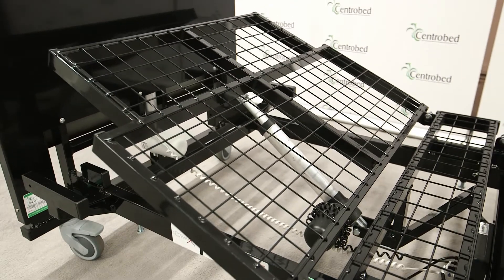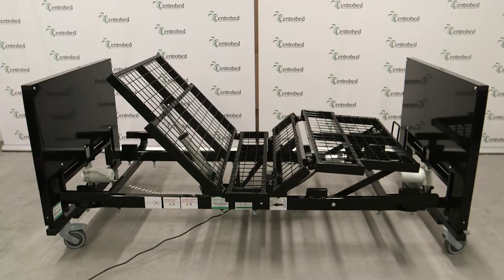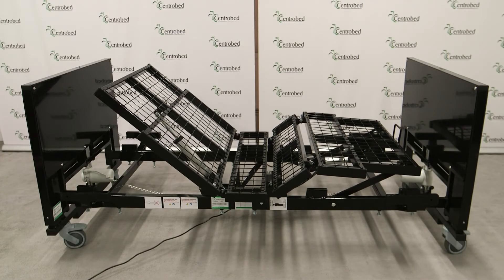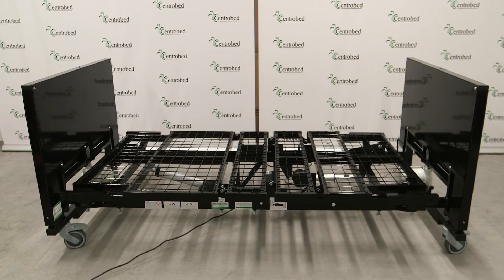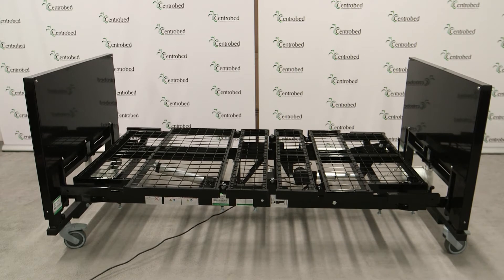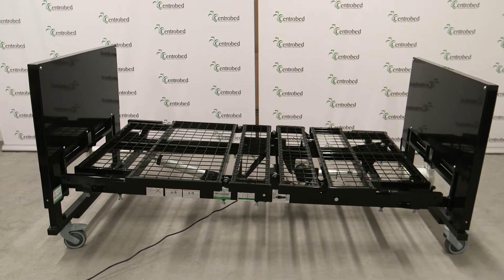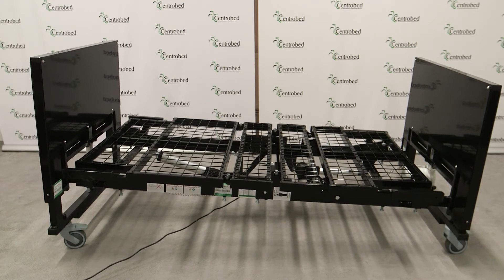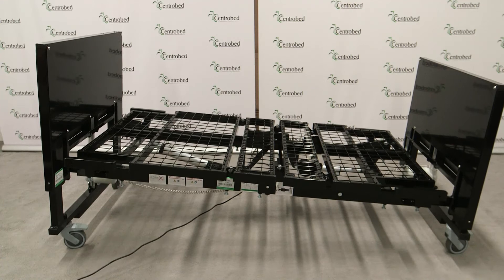We also do a pullout version where you can elongate the bed if you need it — it'll have a pullout on the toes end and on the backrest. We can also make a low start on the foot end, and I think we've got one to show you today. What that means is the motor sits in the end but keeps it low, so you can see over the footboard — just something about four to five inches above the mattress.